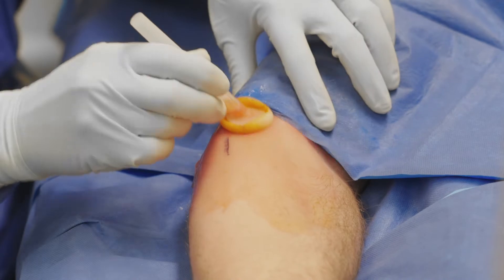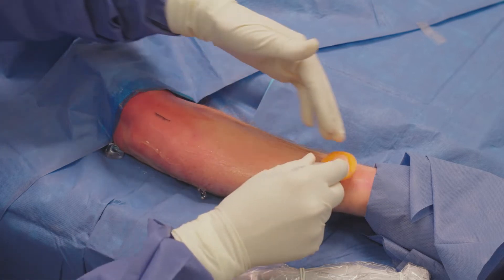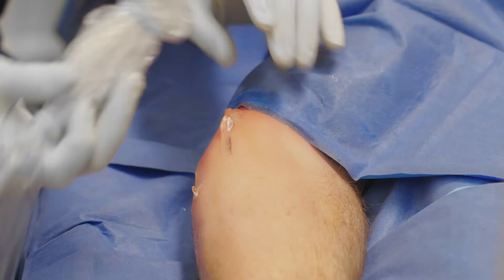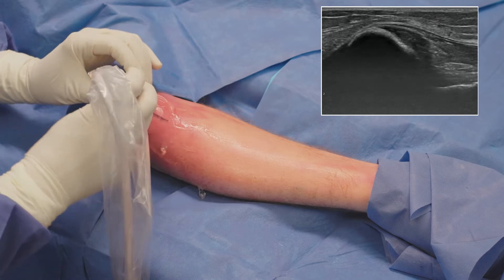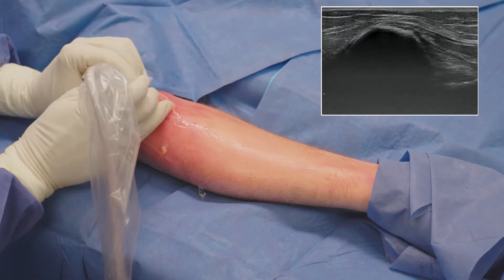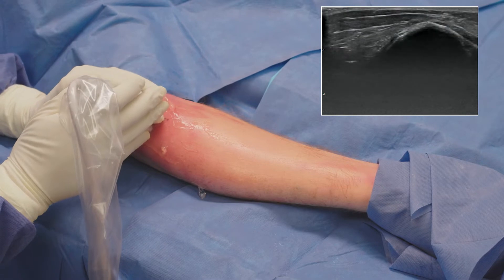Prior to the procedure, the patient is draped and prepped in a sterile fashion with the patient's arm placed in an externally rotated position to expose the medial epicondyle. The procedure is performed under ultrasound guidance to visualize both the pathologic tissue as well as the positioning of the TenJet device. Once I have identified this, I begin to scan the tendon in an axial and longitudinal view to identify and confirm the location of the pathology.